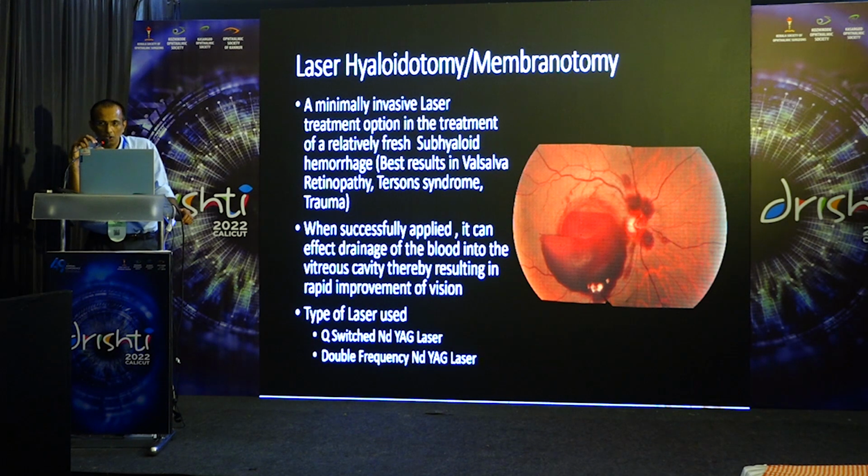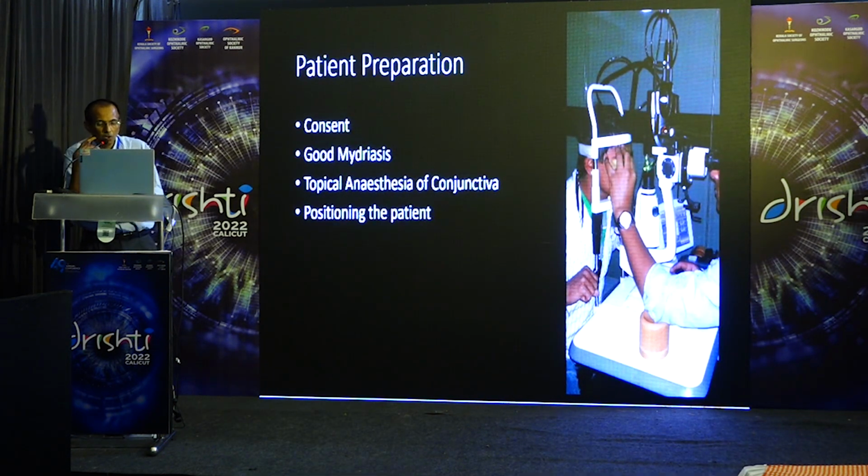So for the type of laser used, we have the Q-switched neodymium YAG laser, the same one which Dr. Deepa was talking about earlier, and the double frequency neodymium YAG laser, which we usually prefer. The patient preparation is like any other laser procedure.